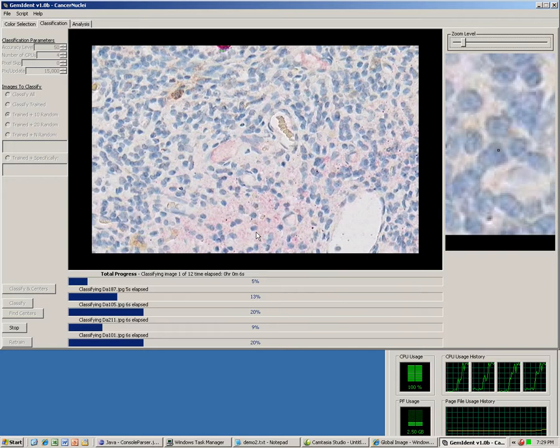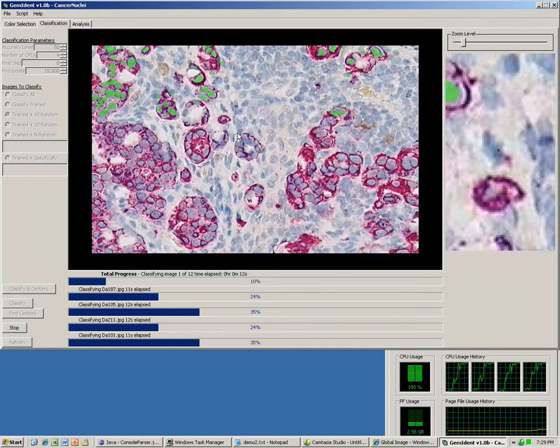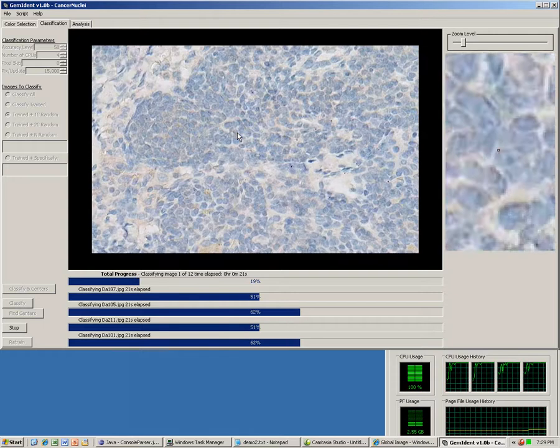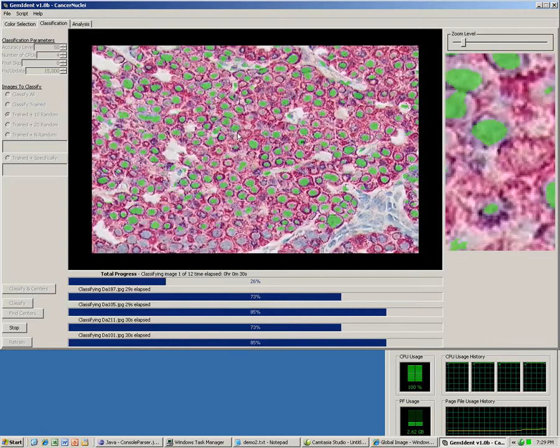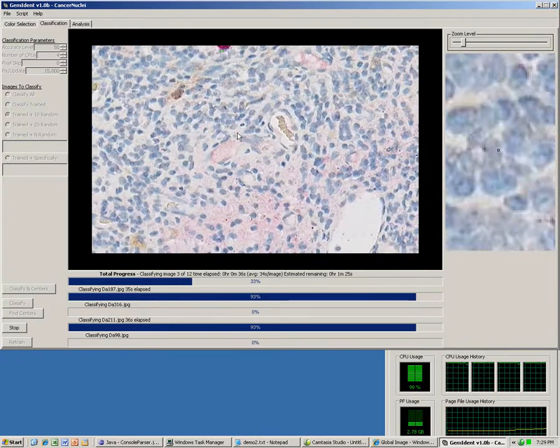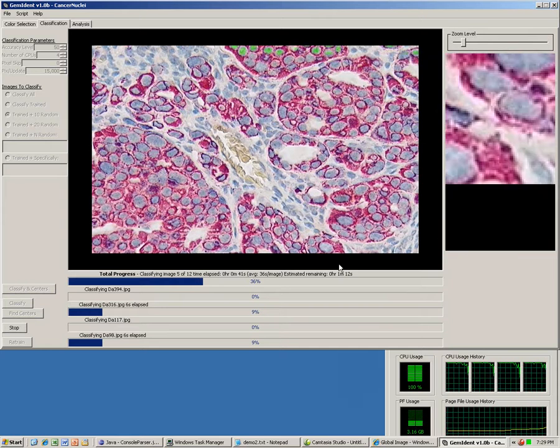This demo is being run on a quad-core AMD 2.6 GHz with 8 GB RAM running on Windows XP 64. GemIdent was designed with multi-threading in mind. With 4 cores, it will identify 4 images simultaneously. This is why we constantly observe the images switching back and forth as the identification moves in real time from the top to the bottom. The pixels that it thinks belong to a cancer nuclei will be colored by our display color, the neon green. It seems to take about 34 seconds to complete each image, so there'll be about another minute or so left.